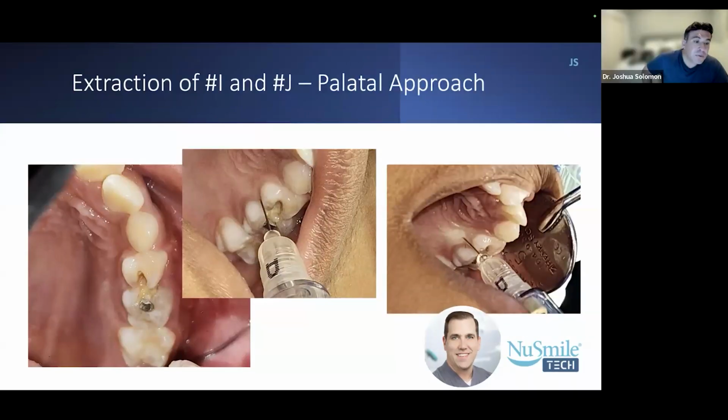And I want to make one point here on how Dr. Bond has that needle angulated. Now, he's giving stage 1 almost vertically here, okay? I want you to be careful doing this because it is a little easier, if that patient moves or you move, to poke the periosteum and you have an unhappy patient. So if you're going to give in this orientation, please make sure that you have that bevel facing out and you just lay the needle and you're not pushing down.